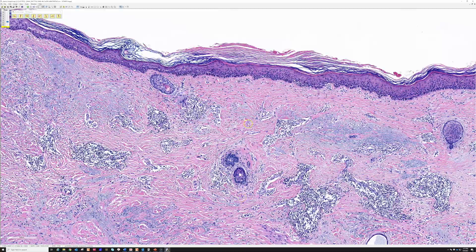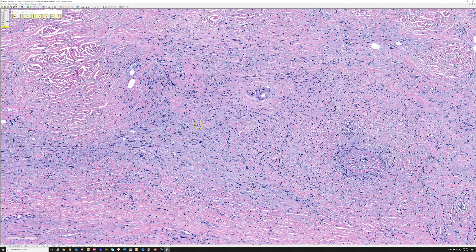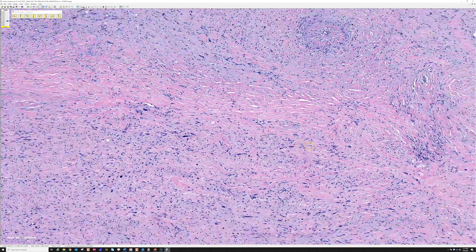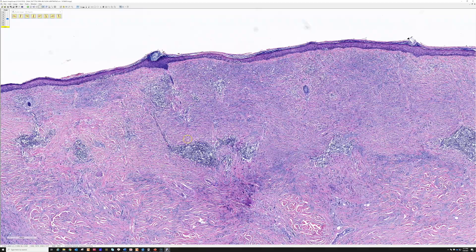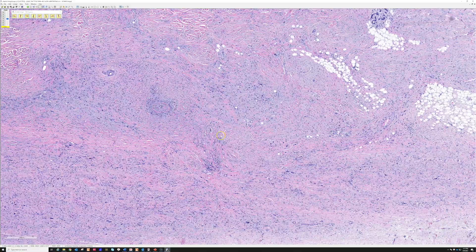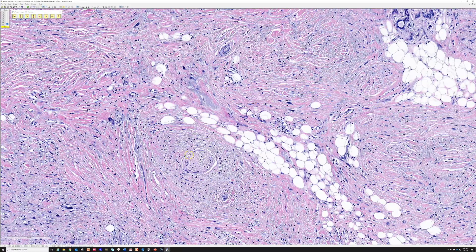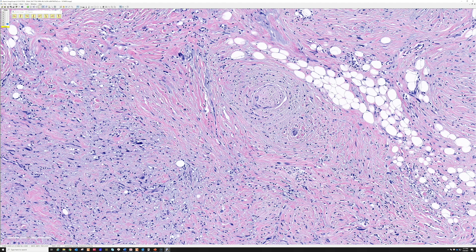The scattered atypia in this sclerotic and myxoid background is the key feature. We're also seeing scattered lymphocyte aggregates, which is one of the most helpful clues even from low power. And finally - look at this - a nerve wrapped around by these spindle cells. This is a classic example of desmoplastic melanoma.